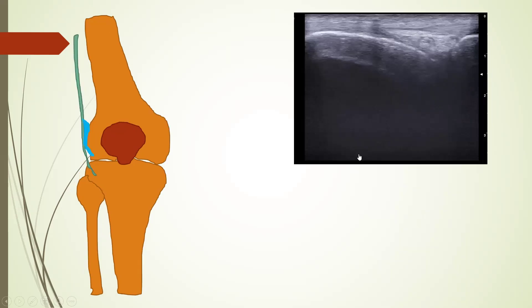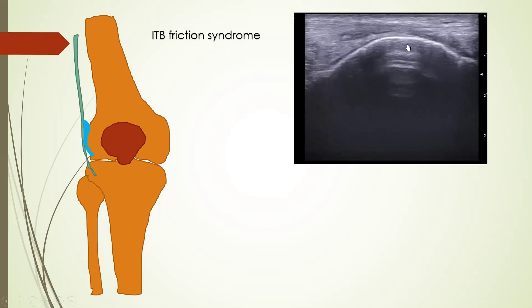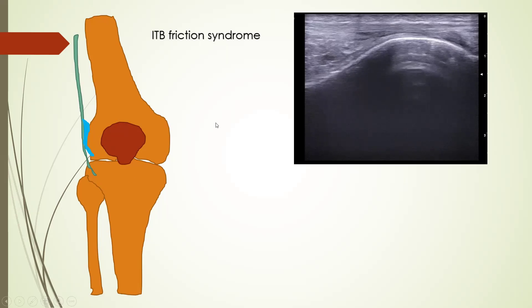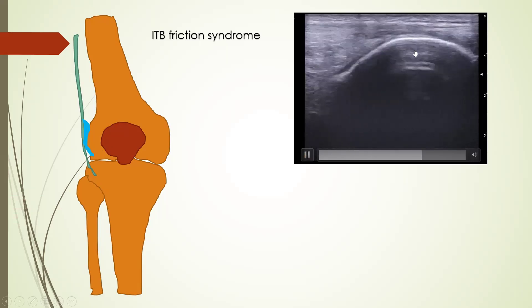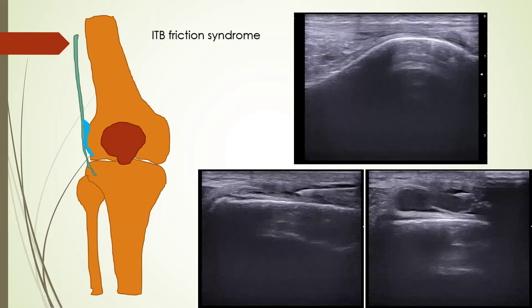Next is iliotibial band friction syndrome. The iliotibial band is a lateral structure that attaches over the Gerdy's tubercle of the tibia. Friction between the iliotibial band and the lateral femoral condyle leads to fluid and edema between the band and the condyle. It occurs in runners and cyclists involved in constant flexion-extension of the knee. In this video we can see fluid deep to the iliotibial band between it and the lateral femoral condyle. A steroid injection can be administered in the surrounding region to relieve symptoms.